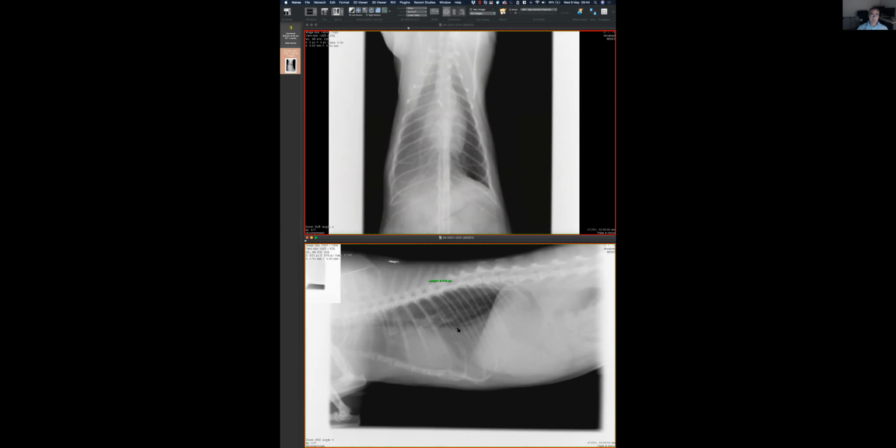And somehow we should have managed to go to the idea that there is just fat in that pleural space. Makes sense? Everything is there. I guess the reason why we don't think about it that much is because it's quite unusual. So we are trapped with the idea of fluid, we can get out of that. We are trapped with the idea of lung. But if you go further, there were problems with those hypotheses. And then coming back, everything makes sense. Everything is there, and there is no conflict.